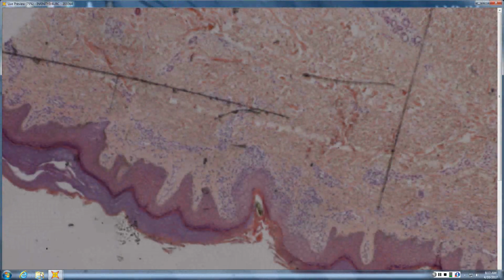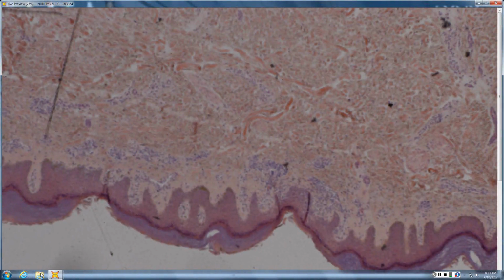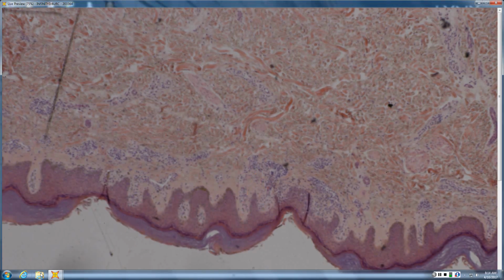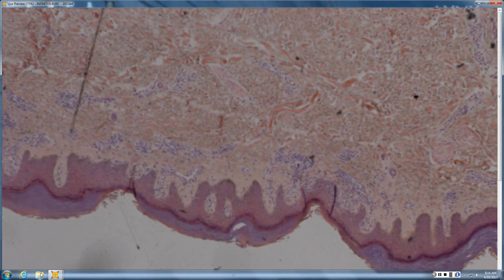So there's some orthokeratosis, and there's also a little bit of superficial perivascular infiltrate, and some of it seems to be tagging the DEJ, some lymphs filling holes and percolating up into the epidermis. So I'd be a little worried and want to look closer for MF. Yeah, you've got some linguini type collagen or bundled collagen above the postcapillary venule, which would not be good. You'd look to see, I'd say the infiltrate's kind of both around top and bottom of the vessel, not so much a bare underbelly, but you might start worrying about MF, given that you have papillary dermal fibrosis, it's a chronic process, hyperkeratosis, and you have some basilar tagging, lymphs in the epidermis without a whole lot of sponge.